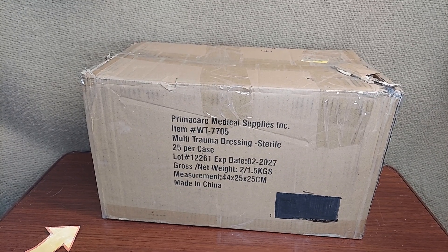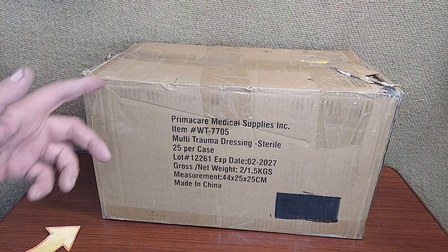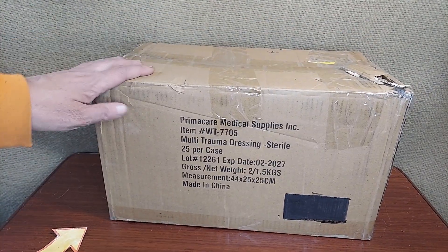Getting ready to fill up some of the trauma kits. We got 25 multi-trauma dressings — these are sterile dressings. This is how big the box is. Let's open it up and take a look at them.